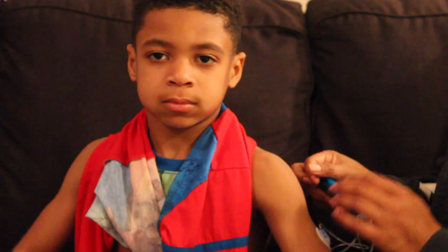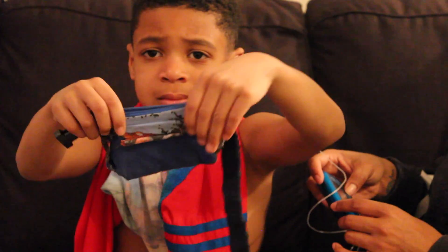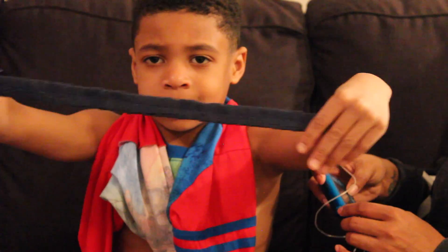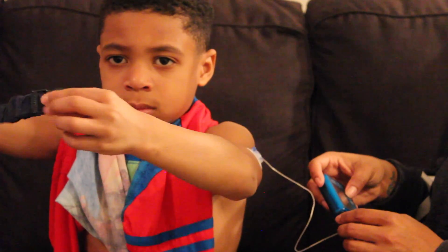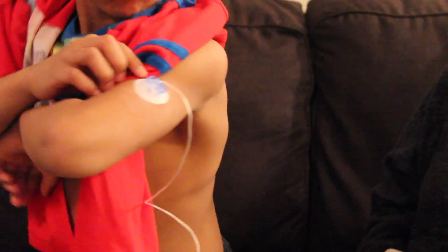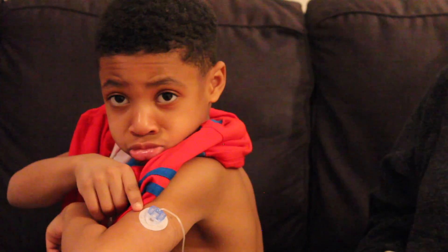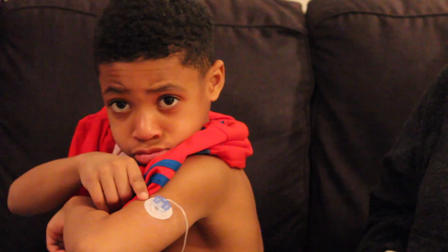Now I simply hook him back up, and he is showing you his insulin pouch. This insulin pouch has been through the wringer — we've had it for four years, so don't mind it. But look at my big boy — he has his infusion set on. This is his lifeline.